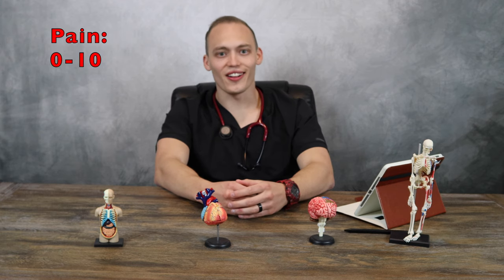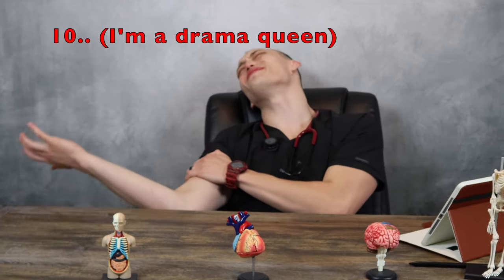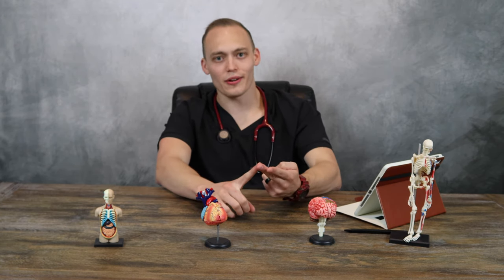After oxygen saturation, I like to assess pain. In an adult, pain is measured on a scale of 0 to 10. 0 being no pain at all, and 10 being — oh my gosh — my arm is being sawed off. You want to make sure a patient's pain is under control because if their pain is not under control, it can most definitely throw off their other vital signs. They could potentially have an elevated heart rate, elevated respiratory rate, and elevated blood pressure.